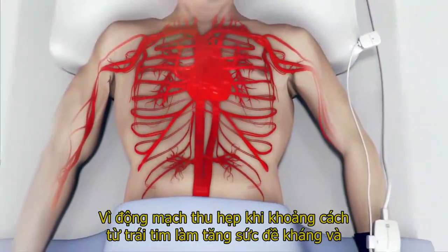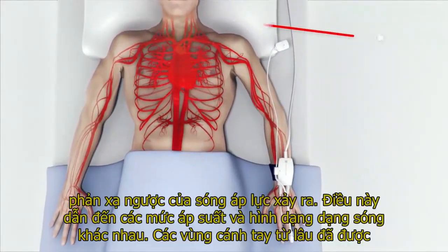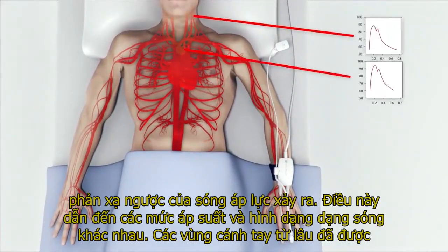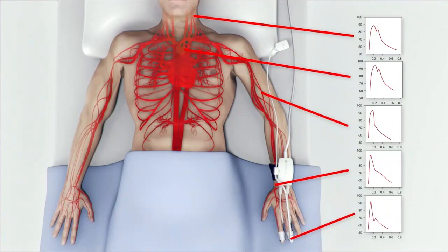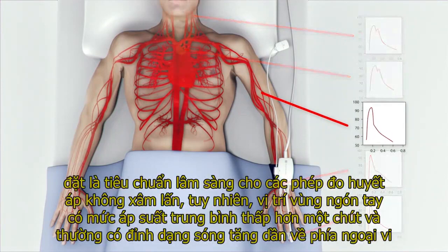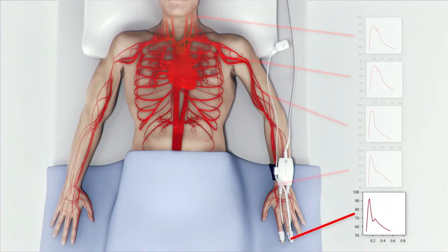Since the arteries narrow as the distance from the heart increases, increased resistance and backwards reflection of the pressure waves occurs. This results in varying pressure levels and waveform shapes. The brachial site has long been the clinical standard for non-invasive blood pressure measurements. The finger site, however, has slightly lower mean pressure levels and usually an increasingly peaked waveform toward the periphery.